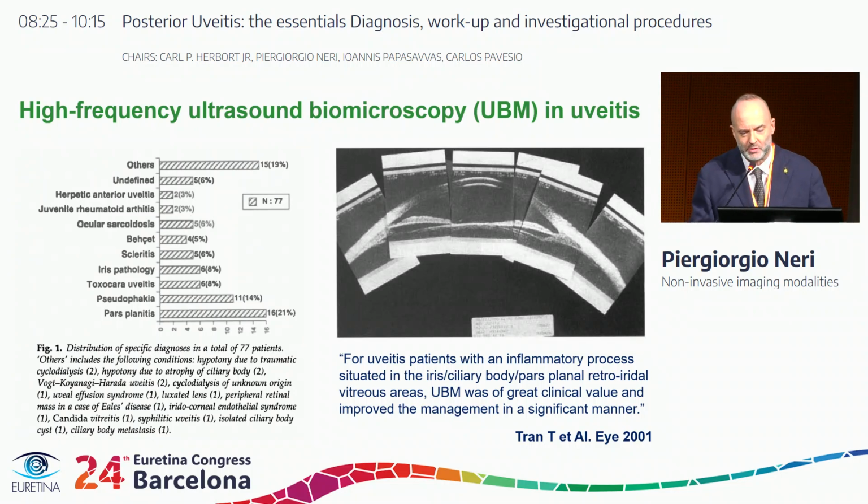High-frequency ultrasound biomicroscopy, UBM. Well, we use it, but certainly with the OCT, we have two techniques that are very similar but not identical. Certainly the UBM can give us other kinds of measures that can help us understand the potential involvement of the different segments of the uveal tract in the anterior segment. I like to mention Tao Tran, who was the very first one a long time back in 2001. Actually, I met these guys from Switzerland at that time, and I can tell you that in 24 years many things have happened.